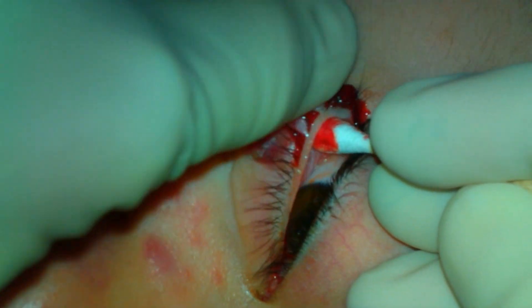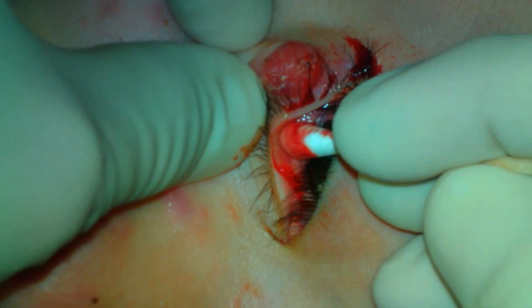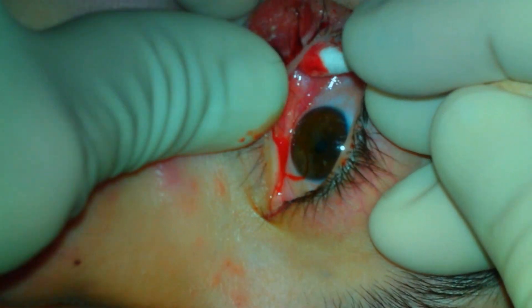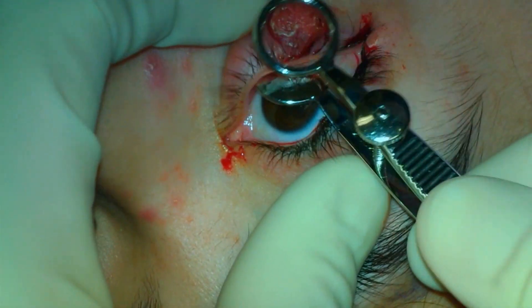The first is a large external chalazion. The meibomian expression is examined and the palpebral conjunctiva is inspected to determine if there is much of a posterior component to the lesion. The lesion will be addressed with an external approach.